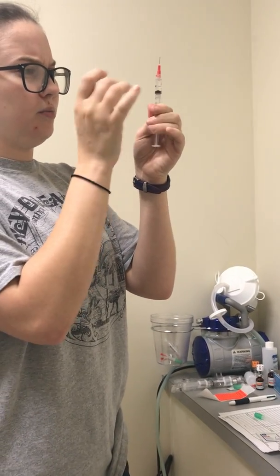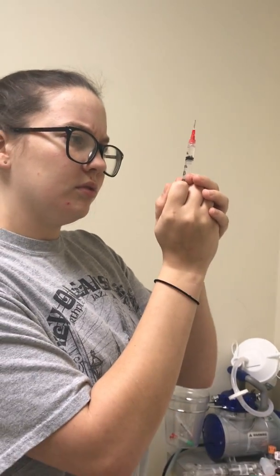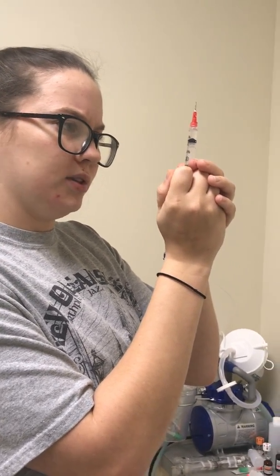I'm gonna make sure I'm getting all the bubbles out. I'm going to 0.6.